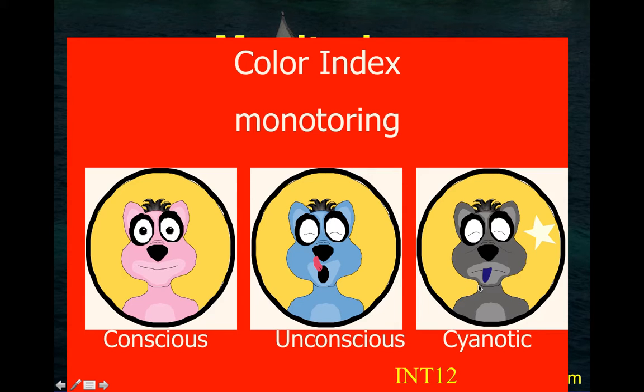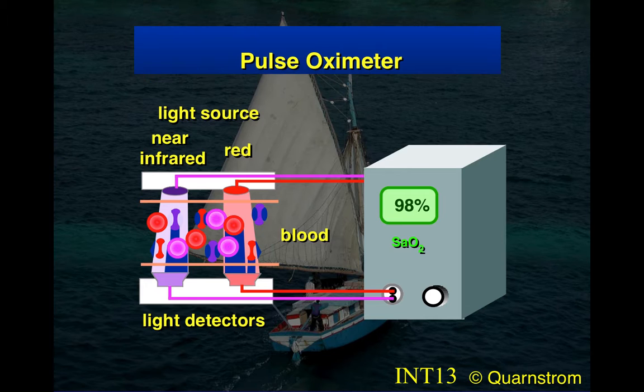Do you need a pulse oximeter to monitor their saturation when they're on nitrous oxide? I think you don't need a pulse oximeter. I think there are a couple of states that require it, and I think that's silly because on nitrous you're getting typically 70% oxygen, 30% nitrous oxide. In room air you're getting 21% oxygen, so you have three and a half times as much oxygen breathing your nitrous mixture than you do breathing room air. And so consequently, your saturation of hemoglobin will always be 100%. So it really doesn't tell you much.